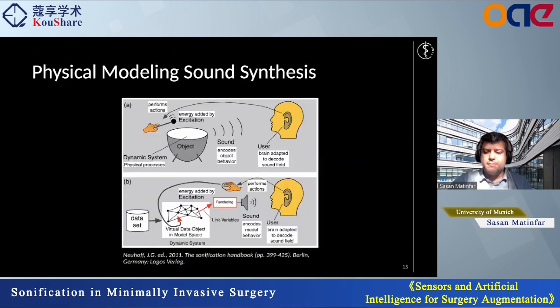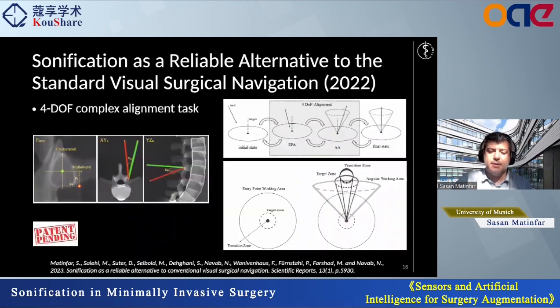Here we used physical modeling synthesis as a technique where we generate a model based on our data, and we create this model by defining some physical and mathematical equations to transform it into a sound-capable system, so that the user can interact with this system like musical instruments, and the sound is generated based on the data set that we created the model from. These were pretty much older works that we have done.